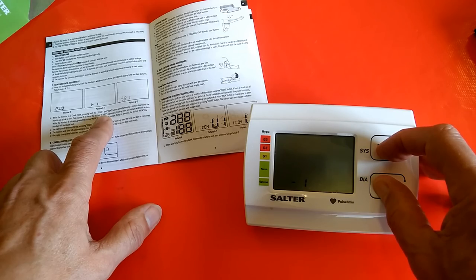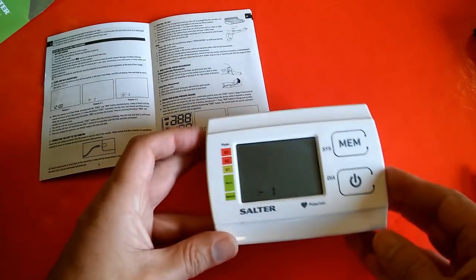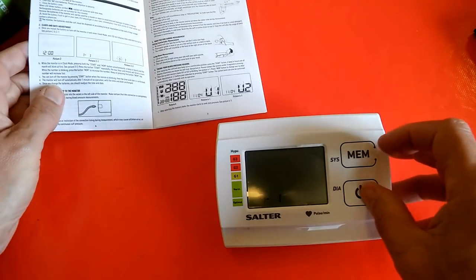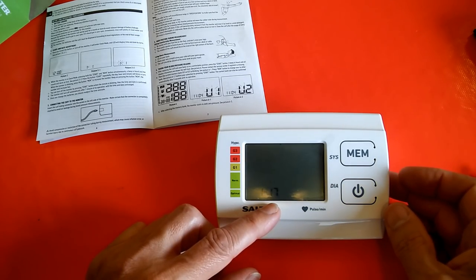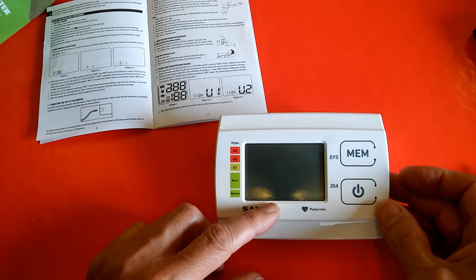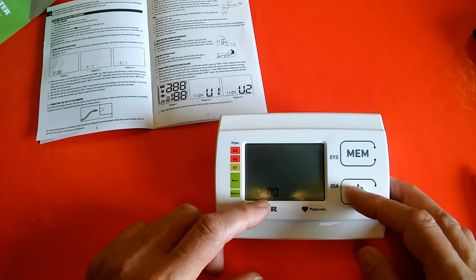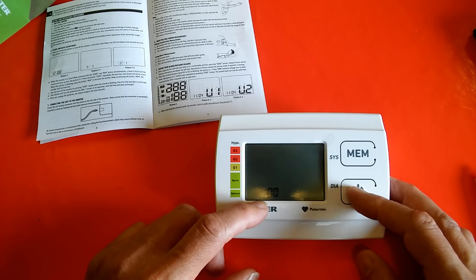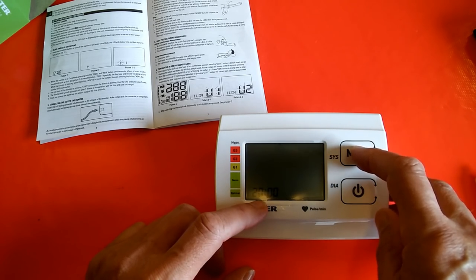A beep will be heard. I didn't hear a beep. Did I miss something? Start... Seems to be in mode already. Definitely didn't hear a beep. Month is blinking — no, that's not month, that's hours, isn't it?